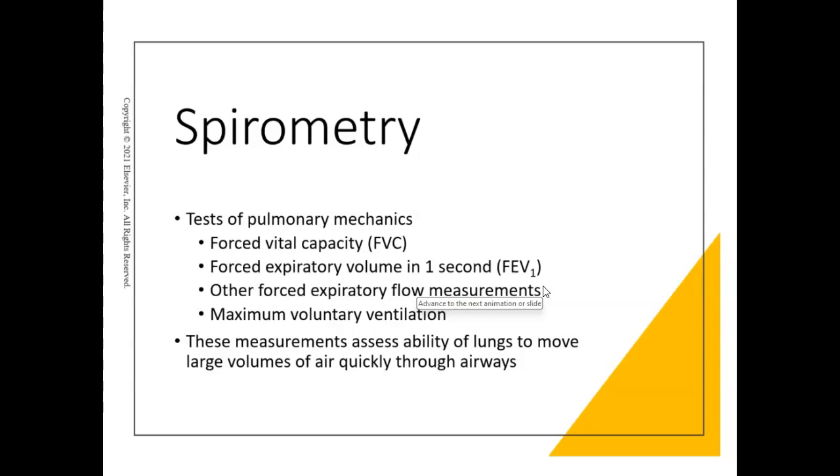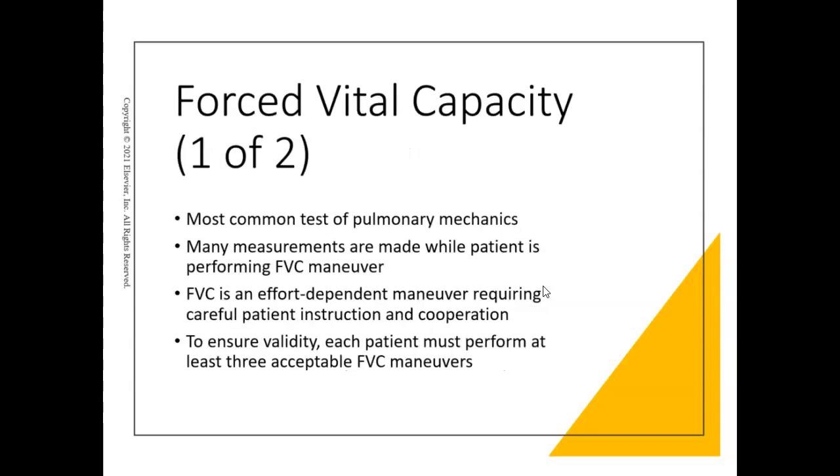There are other things to look for on your spirometry test as well, like the presence of a cough, which would invalidate the test results, especially if it happens within the first second. Also, a breath hold at the beginning, or the patient failing to exhale for as long as necessary to reach baseline, are invalid results, and the patient would have to redo the test.